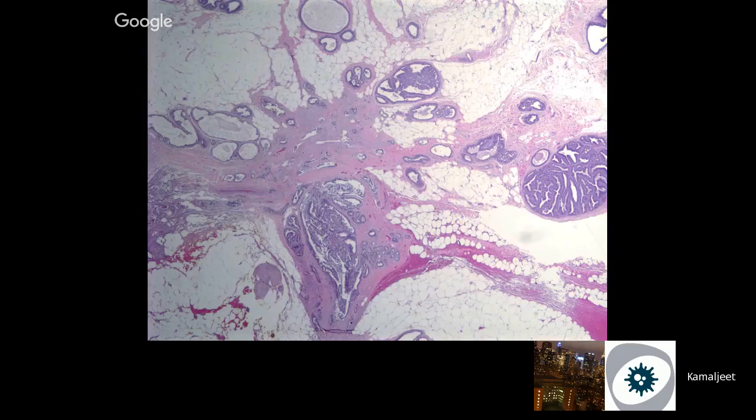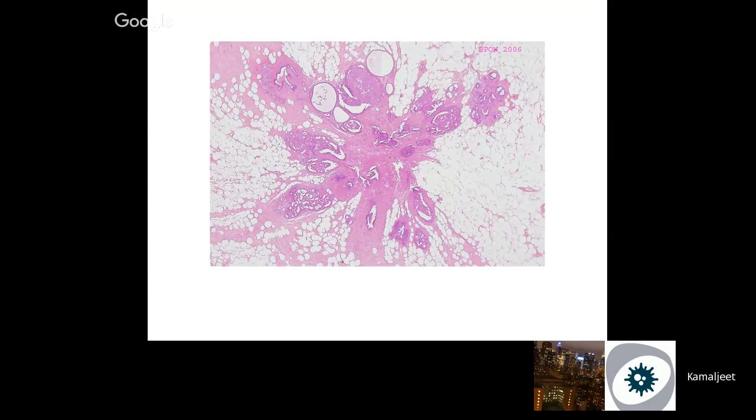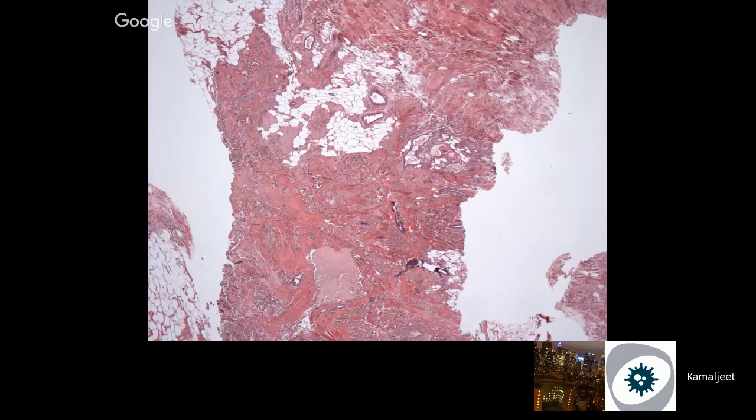Another picture of a radial scar with fibroelastosis, and usually they are associated with usual type ductal hyperplasia, cysts, and sometimes micropapillomas. More pictures of the radial scar. This is in a biopsy, so apparently there has been discussion like, do you really need to excise it? If it's a target lesion, it will get excision, because many of these are associated with low-grade carcinomas, tubulolobulars.